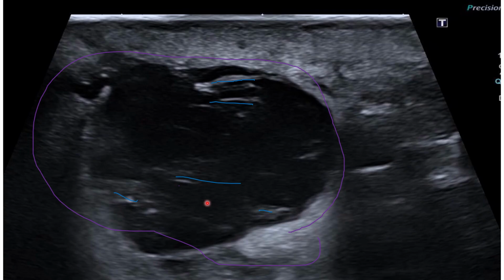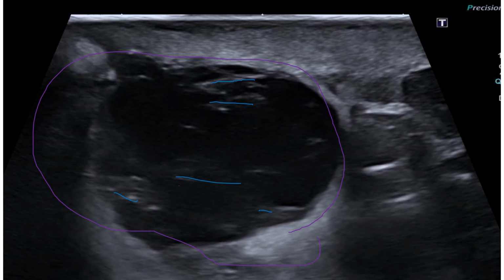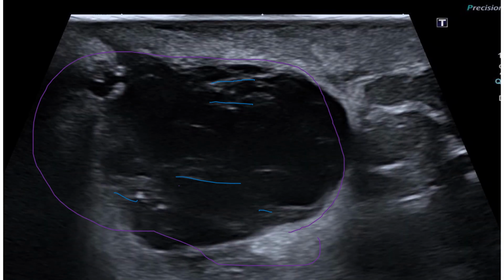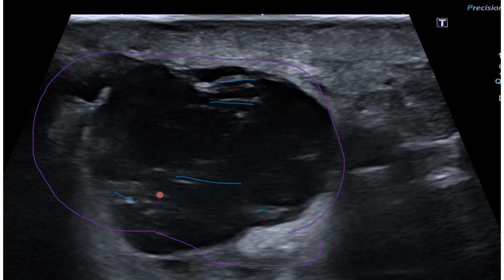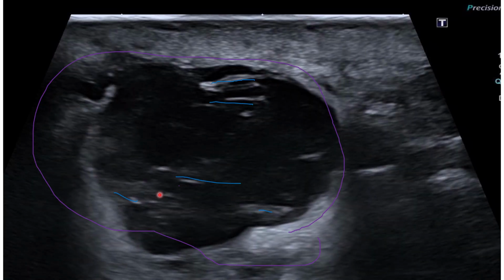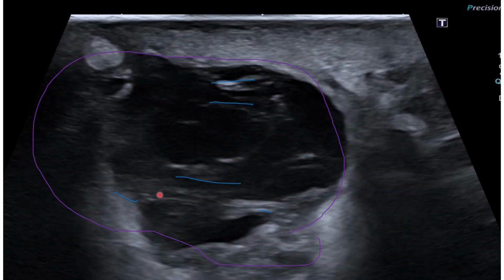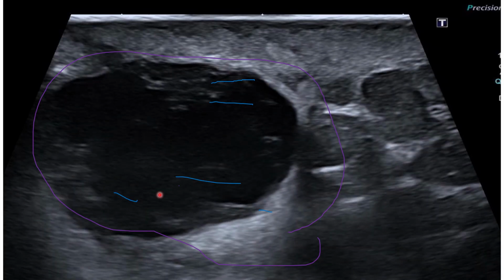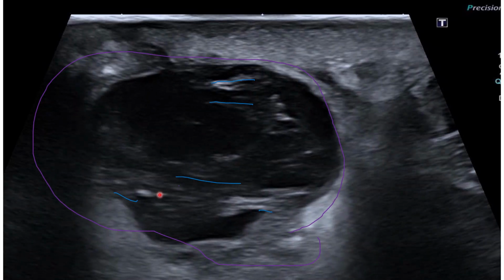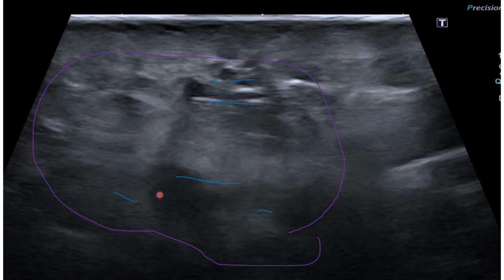This is a post-operative complication. This is part of the incisional line where you are now seeing a collection of blood that has formed. So this is a hematoma. Those are some of the challenges that come with operations. Infections can come, bleeding can happen, post-operative bleeding can happen.